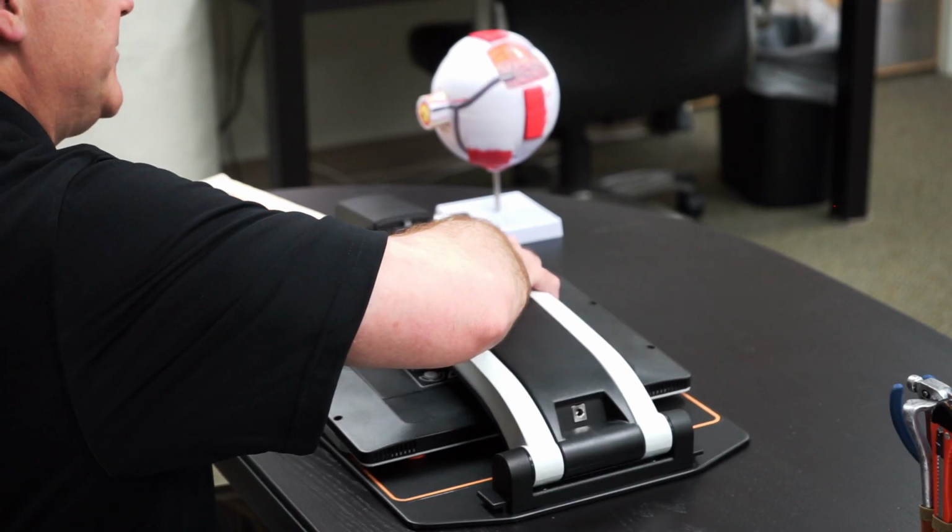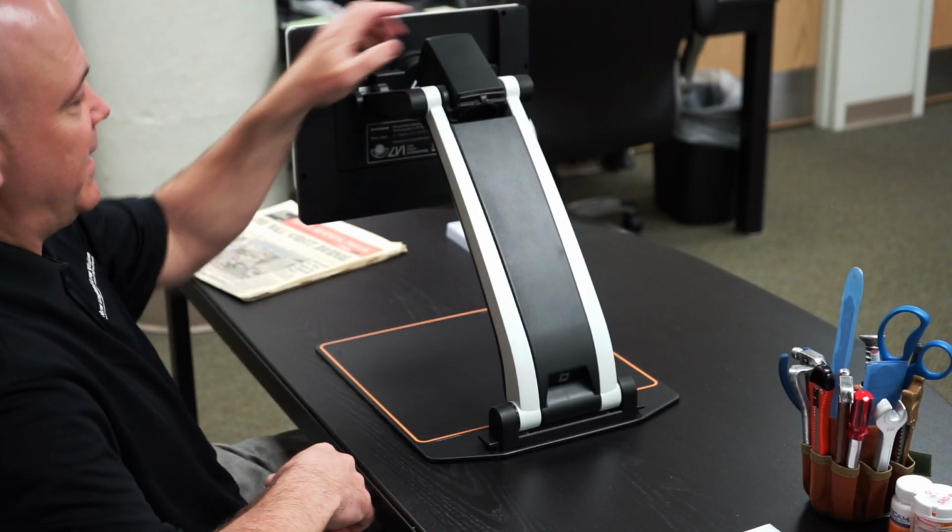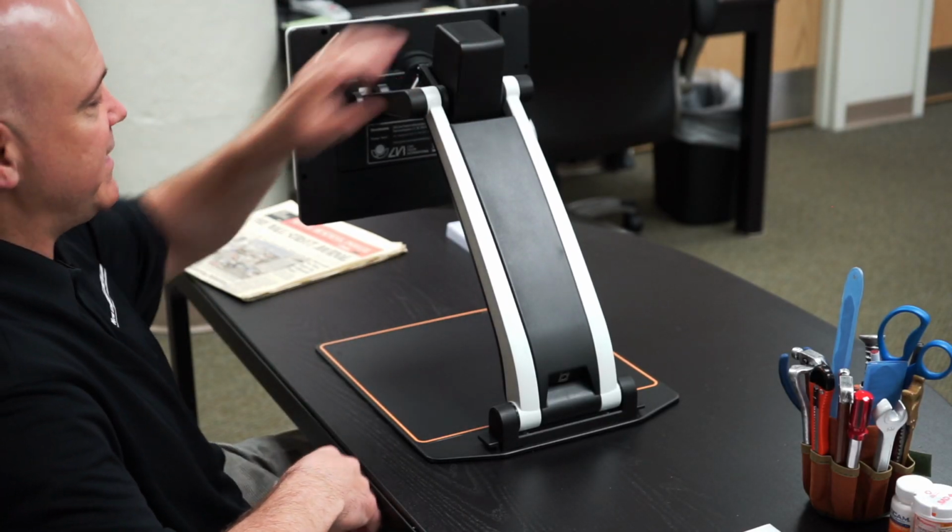So you take it out of where you're storing it and you want to use it. It's just counter pressure. So I'm going to be pulling up the spine and holding down the base, and you're going to hear a click. Ready? 1, 2, 3. There's the click. And now the monitor is still tucked into the spine, so I'm just going to untuck that by removing it like this. And then the camera is aiming into the spine. We don't want that. We'll aim the camera straight down.